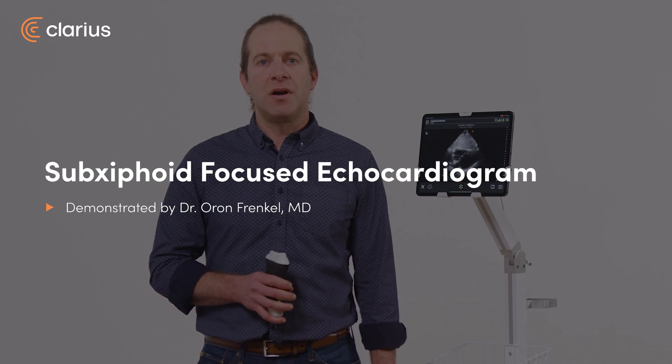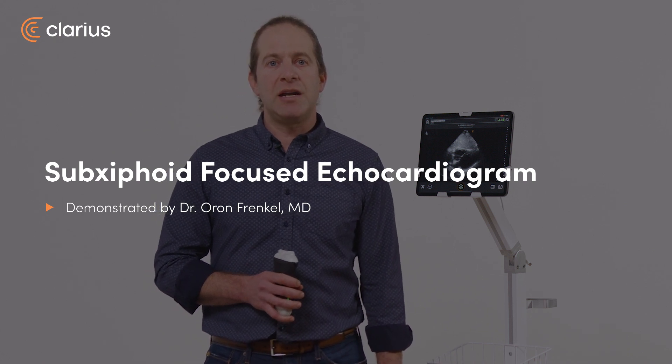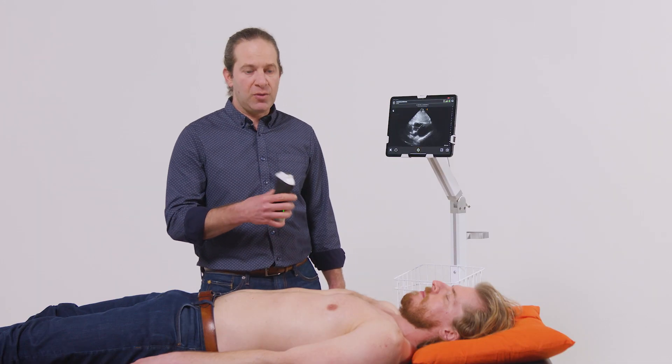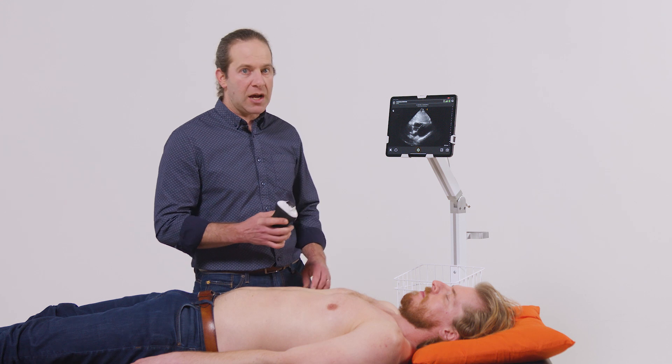I'm Oran Frankel, an emergency physician. Focused echocardiography can provide an immense amount of information in patients presenting with chest pain, dyspnea, or abnormal vital signs. Part of the protocol usually involves a subcostal view of the heart, and here I'll show how to perform that with a phased array scanner on the cardiac preset.